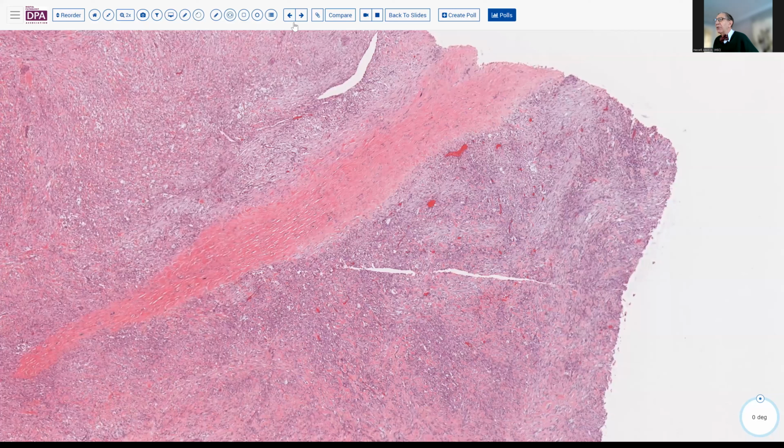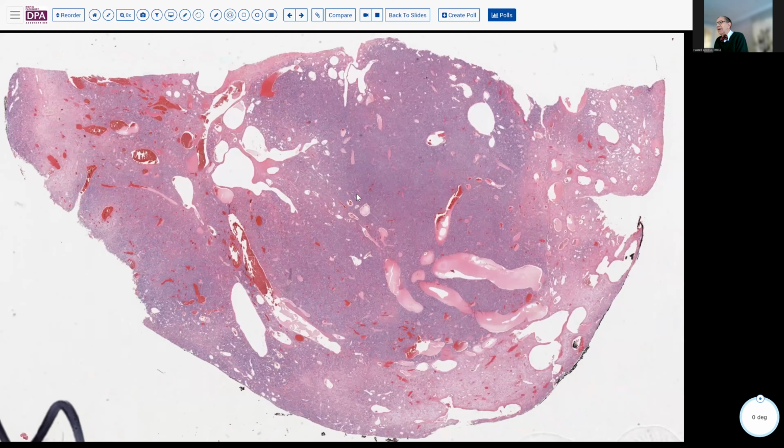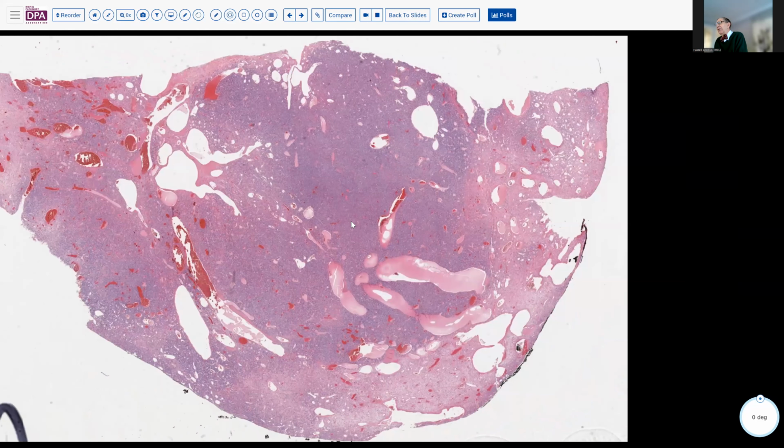Okay, well, we may not get through all of our cases, but I'd like to go through this next case as well, because this is also in the differential of these kind of low-grade spindle cell lesions. This was an intrathoracic, somewhat pedunculated lesion, producing a chest mass, and there was concern for malignancy that led to this being removed.